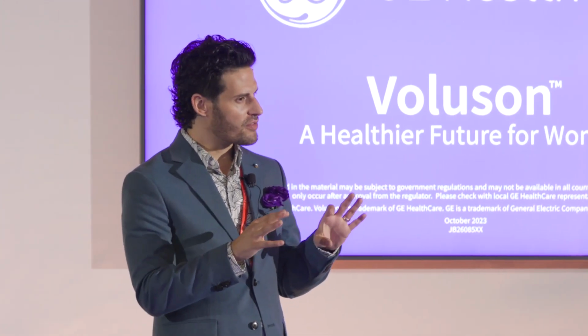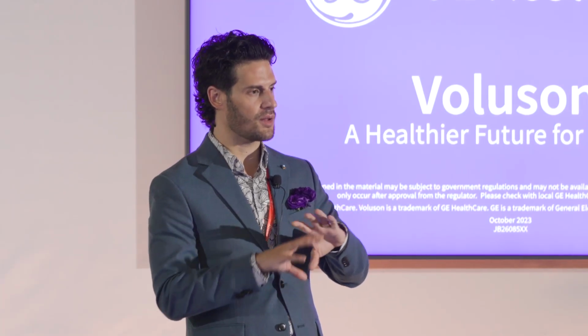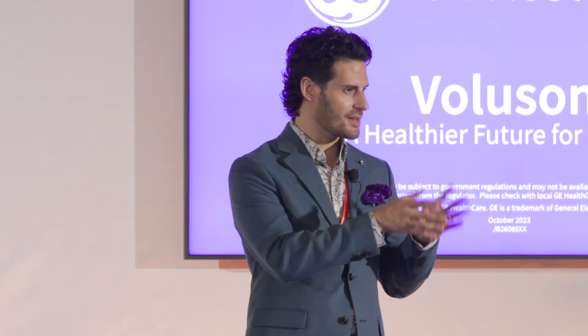From the settings standpoint and the probe standpoint, I don't have the words to describe it per se. I have a setting on my machine and I can probably get a USB and give it to you to plug in. But things are very soft. I make things very soft. I turn the contrast down. I can try and get these settings and share them with you.